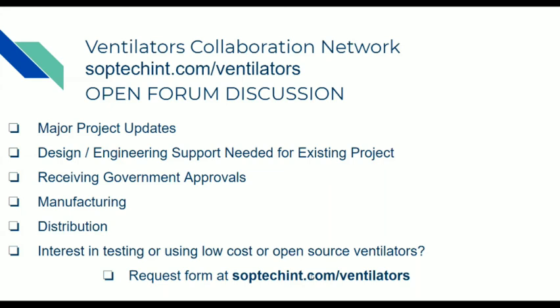So although they are good for immediate use, I'm slightly concerned about their reliability for this application. I'm still looking for alternatives that are more reliable and rated for continuous operations, something like BLDC motors that are used in ceiling fans these days. I just want to understand if anybody has a comment on this.